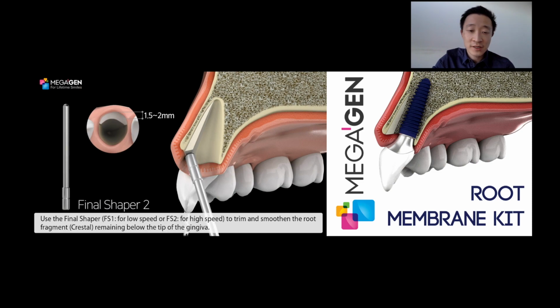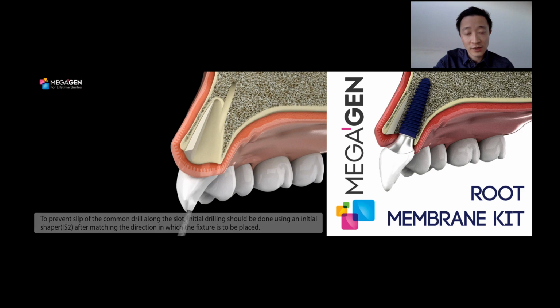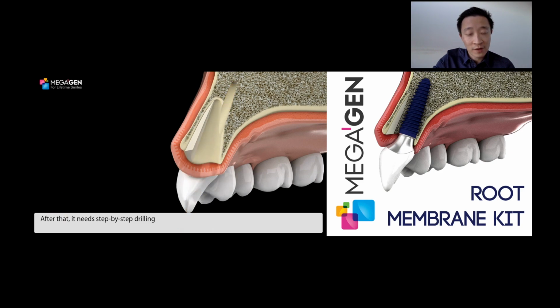And finally, the final shaper 2 lets you provide a bevel for the shield to give a bit more space for the restoration. You can go back to initial shaper 2 to start your osteotomy for the implant. Generally, you want to place these implants towards the palate so that they come out in a screw-retained position, and they are also away from the socket shield.